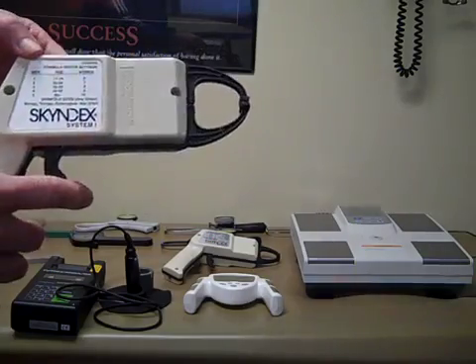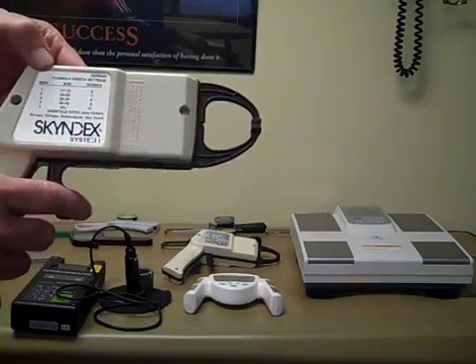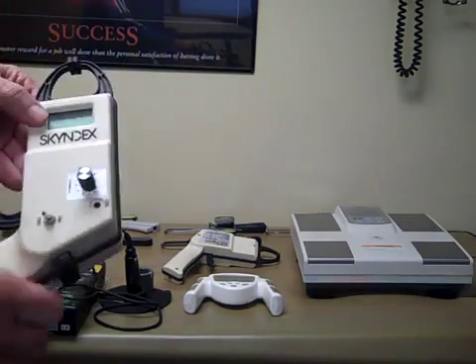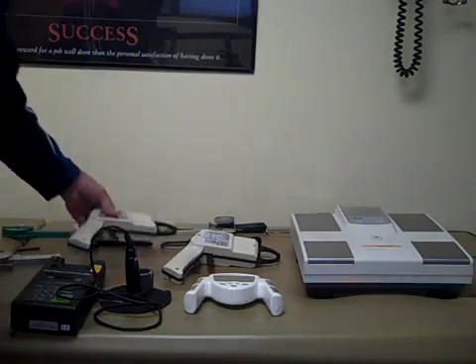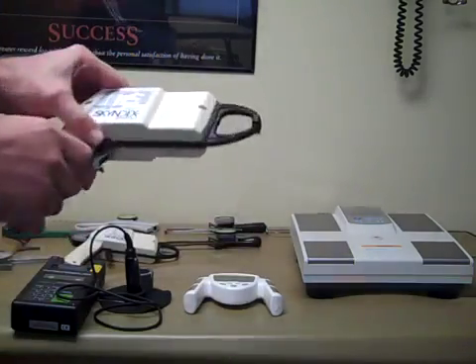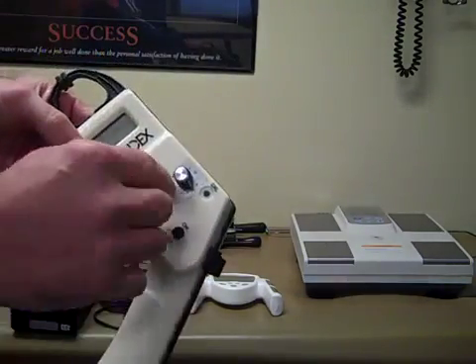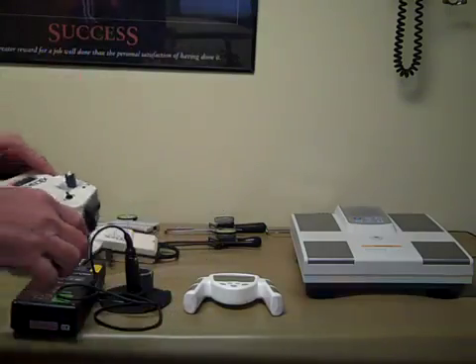Other calipers they have are computerized calipers. This one has the Durnin formula for the different age groups built into the calculator, so as you do your measurement you would get your skin folds and select your equation. This one uses Durnin and Womersley, and this one uses the Jackson-Pollock formulas — you would dial in with the dial and it would tell you each measurement.